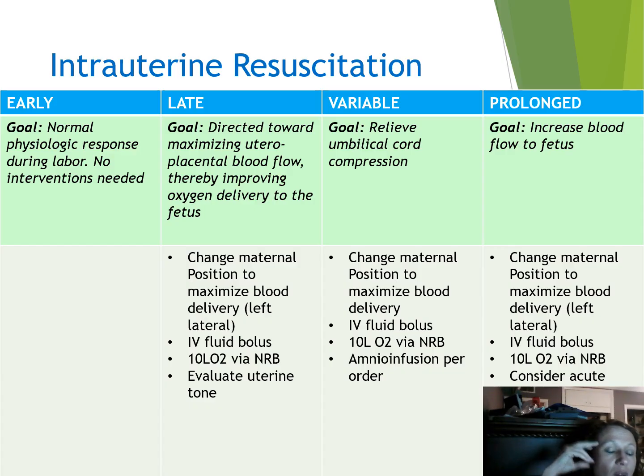We didn't always, and we'll talk about that in a sec, okay? So the very first thing is changing position. Now I should say though, if they have Pitocin going, typically your first answer when you see it on an NCLEX of a woman having late decelerations and she's got Pitocin going is to turn off your Pitocin, okay?